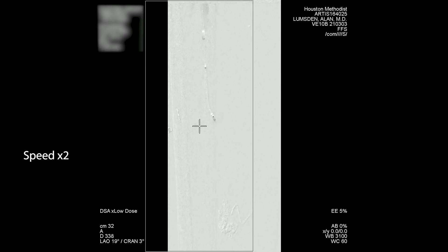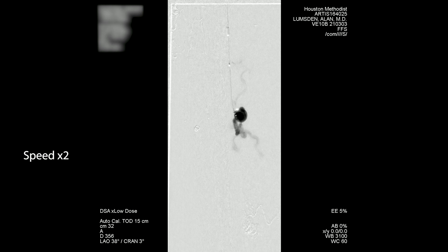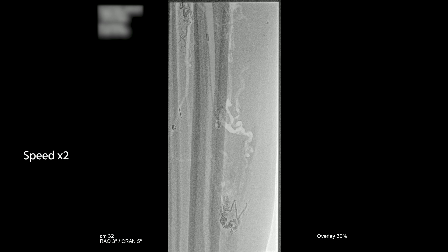We put some onyx in — you want to confirm where you are at all times. What I'm looking at is where the catheter exits from the feeding axial vessels; that's what you want to keep an eye on and make sure onyx is not backing up into that. Since their pain is really right in the subcutaneous tissue, you want to make sure you get these areas. This one is in close proximity to the posterior tibial artery, with dark spots just starting to grow.